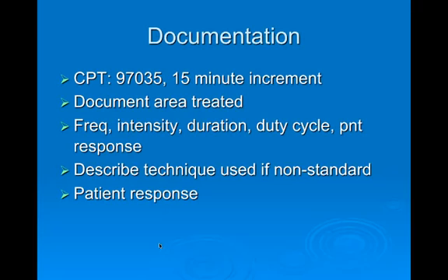You're going to document the area treated, and then everything, so someone else can come along behind you and do the same treatment. You want to be listing your frequency, intensity, duration, duty cycle, and your patient response. Okay, if you did something that wasn't standard, make sure you list that. The thing to keep in mind is just make your treatments repeatable when you write them down.